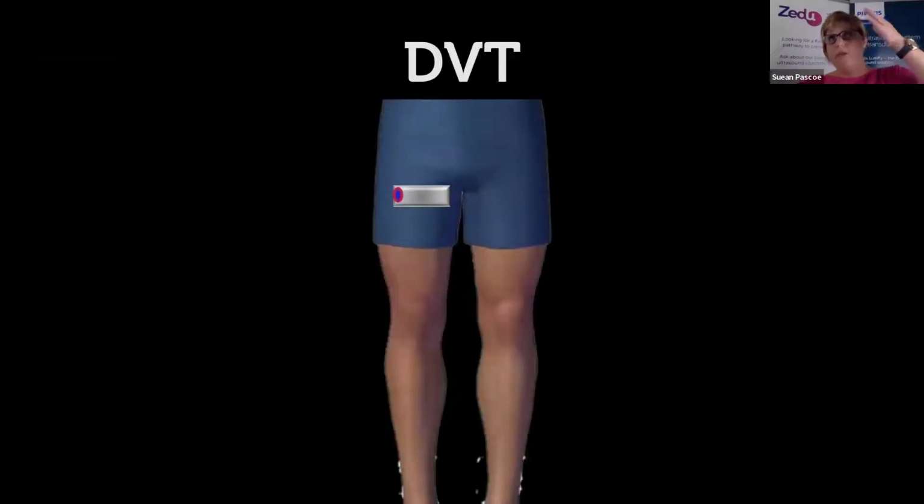Now, the last part of the pump, tanks and pipes is the DVT. I start in the groin here, then I track my way up as far as I can see the vessels, and I'm compressing as I go. Then I track my way down the leg, and usually I just have the patient's legs rolled out and bent up a little, and then look behind the knee. We used to do the 2-point study, but they've done quite a bit of work saying you can have quite a lot of clot happening through here. The annoying thing is that this part of the leg is really hard to look at, so there's a couple of things you can do.